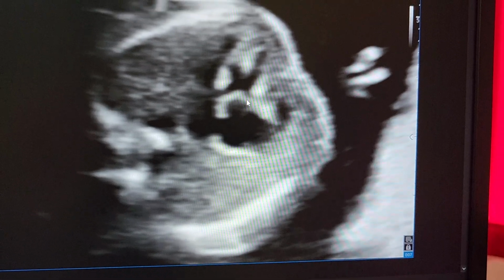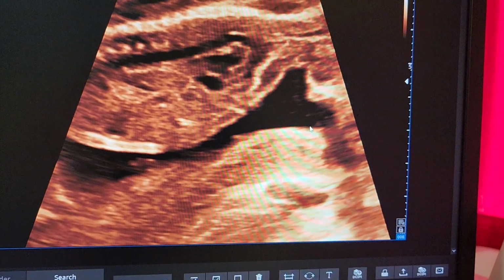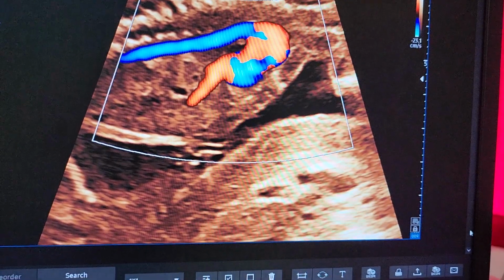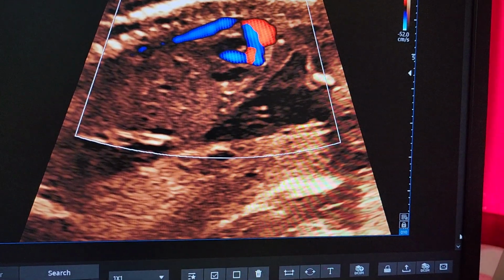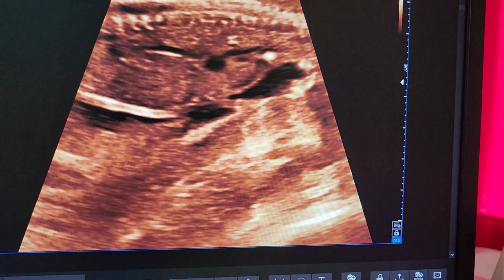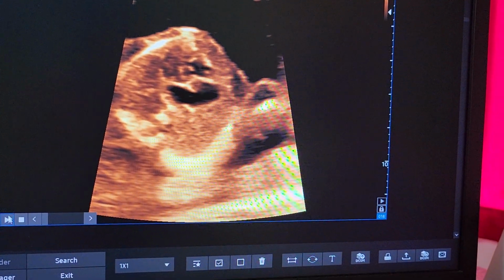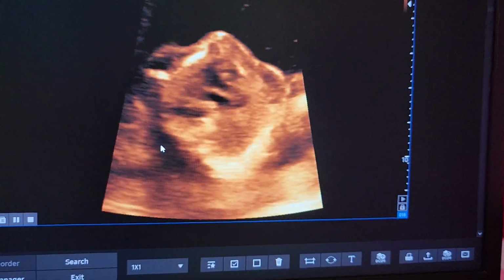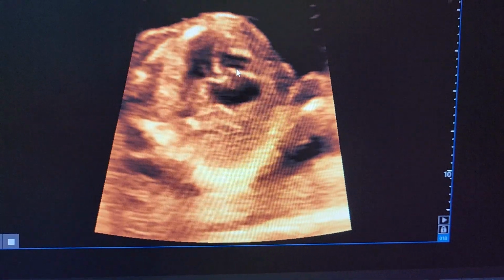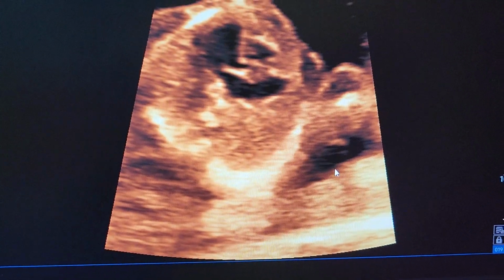Then a freeze frame shows increased echogenicity as we just discussed in the right heart. The fetus has turned and we take the advantage to demonstrate the aortic arch, which seems to be normal in 2D and in color, whereas the ductal arch I was not able to demonstrate properly. Then we waited for the fetus to turn. Once it turned, we again get the four-chamber view and the findings of a small sized RV and a normal sized LV are demonstrated here.